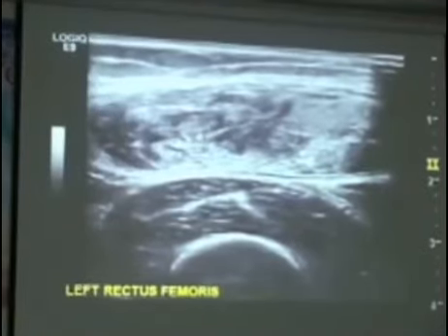Sorry, it's not running. Just using the real-time looking at the tendon or at the muscle, you're able to see that there's quite a heterogeneous area there. So sometimes it's much easier to appreciate these tears just in dynamic scanning than just static imaging.